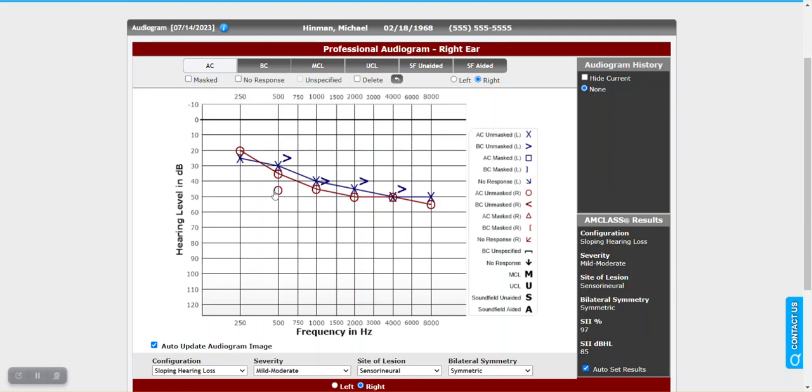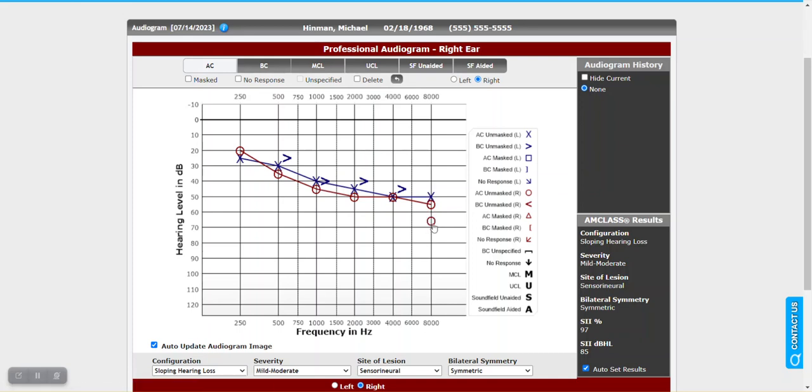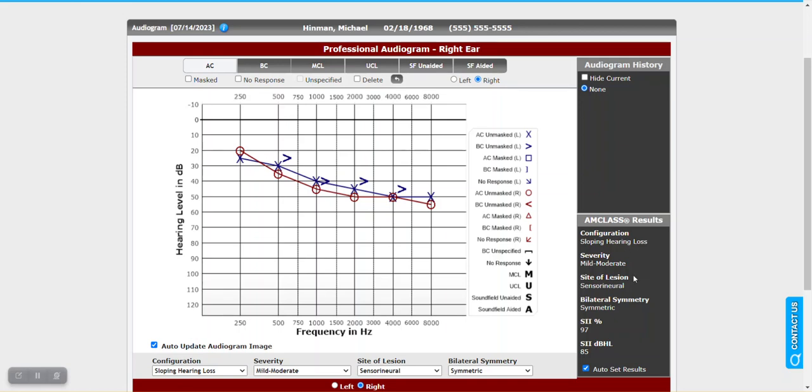For bone conduction it'd be 500 through 4000. So pretty straightforward data. If you find that the classification is not occurring, just check on your thresholds to make sure, for example, if you didn't do 8000 or something, then the classification would not occur. Now off to the bottom right here, we will see the classification. It's broken down into four areas: configuration, severity, site of lesion, and bilateral symmetry. So once again, based on the air conduction and bone conduction thresholds, it'll perform the initial classification.